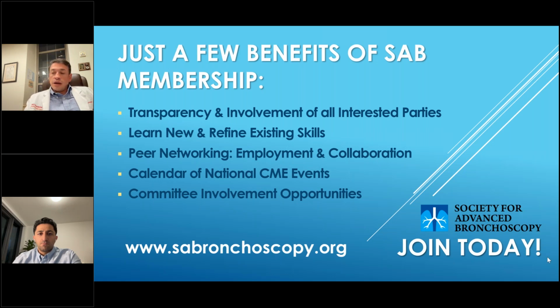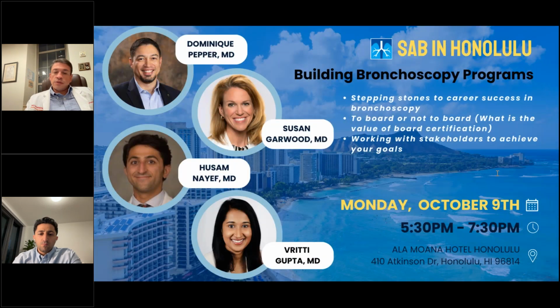I think that ultimately limits your ability, because as much as we love putting in valves, if the fissure is not complete, that, by the way, is the second most common reason for exclusion, the most common being inadequate PFTs, hyperinflation. Unfortunately, we cannot proceed, at least outside of a clinical trial, with a valve procedure. So I think there are a number of patients who get turned away from a valve procedure that potentially could have had LVRS.